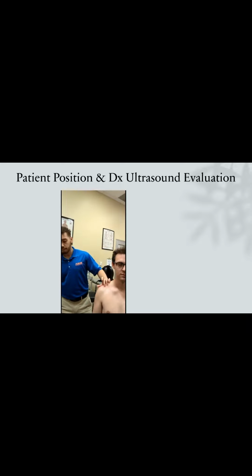The clinician will then apply ultrasound gel medium for the diagnostic ultrasound and ensure that the notch of the ultrasound probe is facing towards the patient. The clinician will then place the ultrasound unit on the patient and begin their assessment.